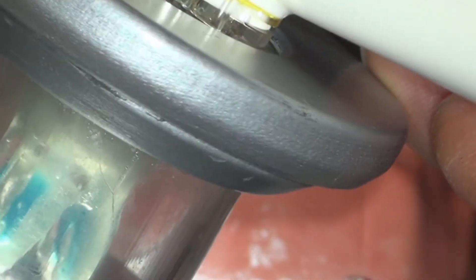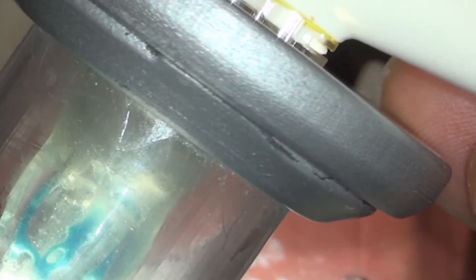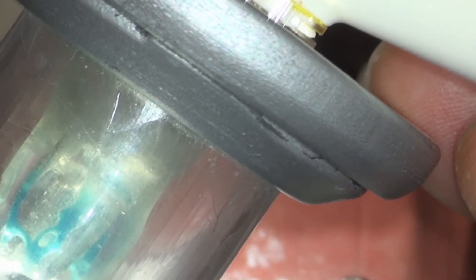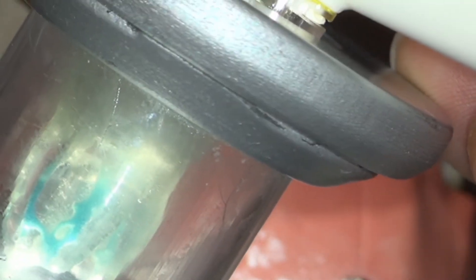If you go out of there, you saw a nice piece come, a little chunk come out there, as it works its way down into the middle and then the apical third.